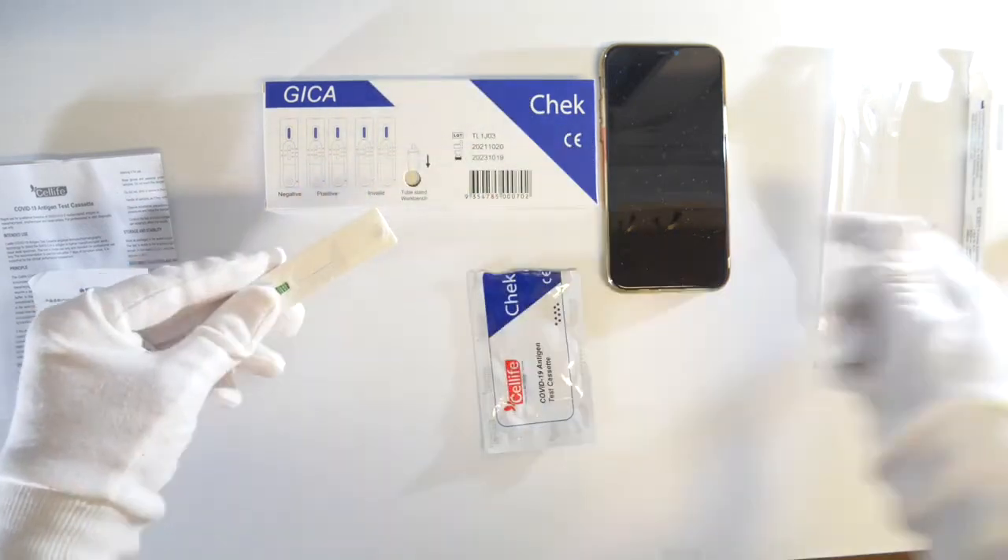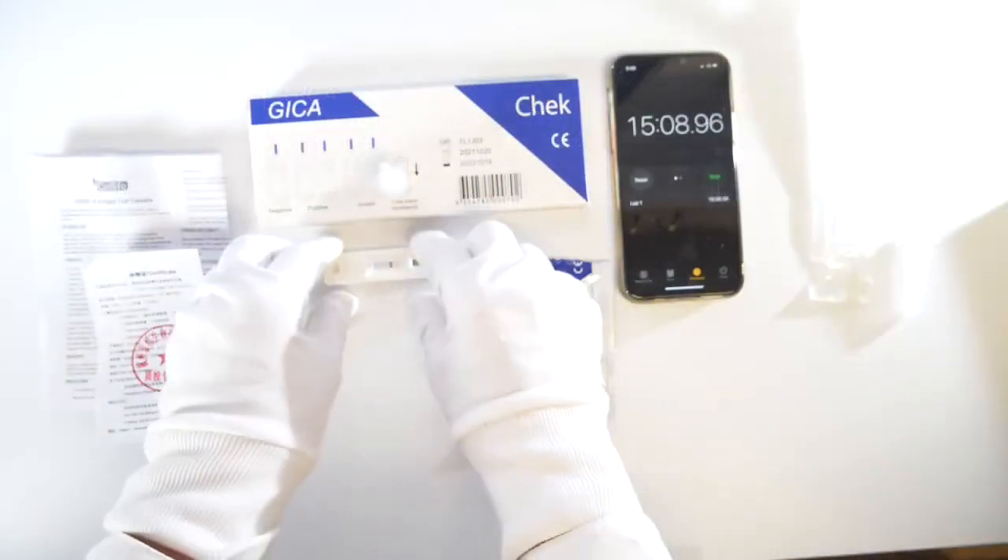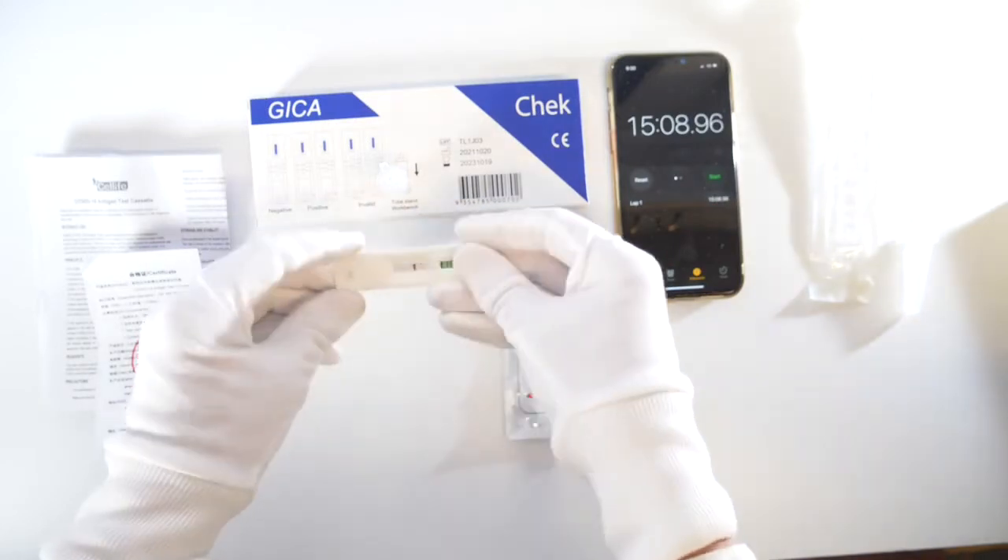Test results will be ready in 15 minutes. Do not check after 20 minutes.